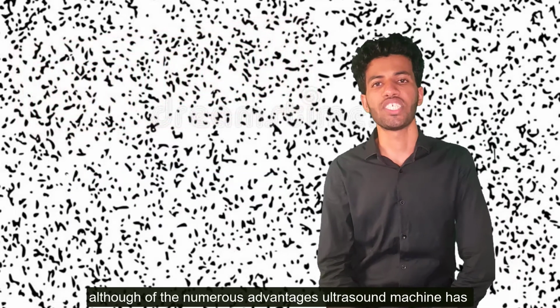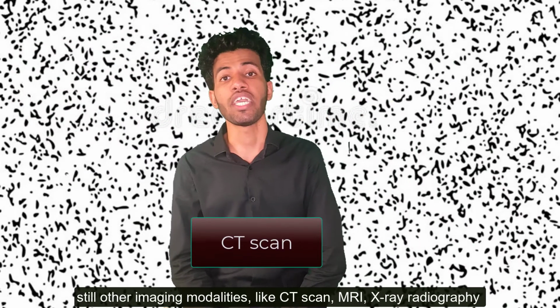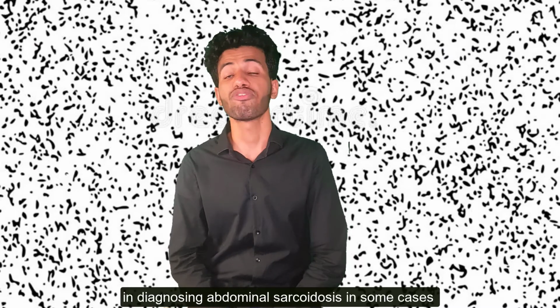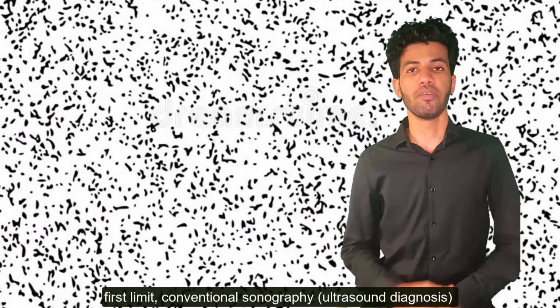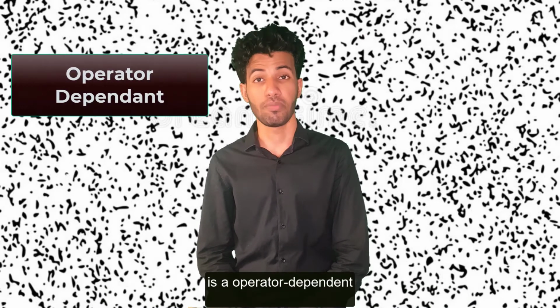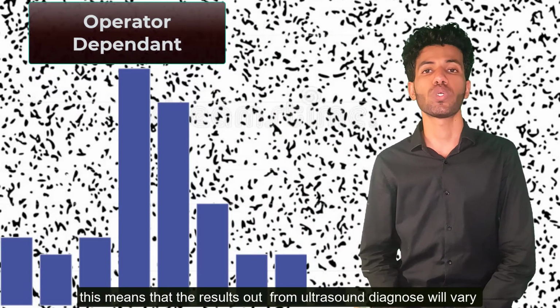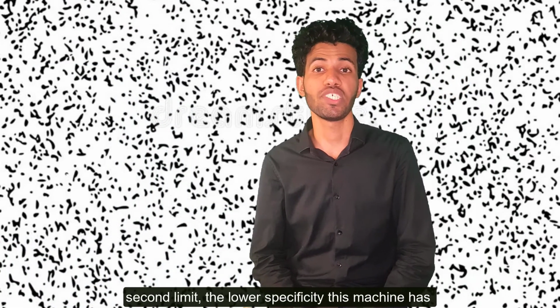Despite the numerous advantages the ultrasound machine has, other imaging modalities like CT scan, MRI, and X-ray radiography are still preferred over ultrasound in diagnosing abdominal sarcoidosis in some cases, because the ultrasound machine has some limits. First limit: conventional sonography is operator dependent. This means that the results of the ultrasound diagnosis will vary depending on the medical technologist using the ultrasound. Second limit: the lower specificity this machine has.